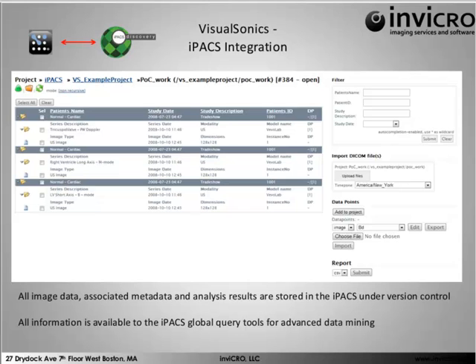But also what's nice is that you'll see we're mapping data according to a DICOM-like standard, and we're involved in a lot of efforts to standardize how preclinical data is managed, both with ultrasound data, but also with all modalities, whether that data is in the form of DICOM or non-DICOM data, so that researchers can quickly find a data set, whether it be an ultrasound image or they want to map directly and find the correlated histopathology data or PET, SPECT, CT, and whatever complement modality you're using to assess that drug or therapy.